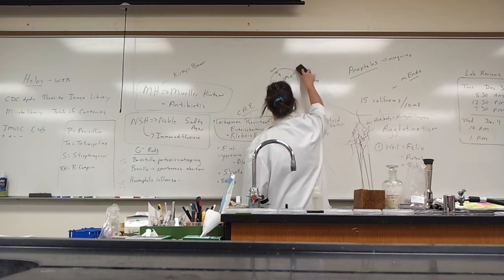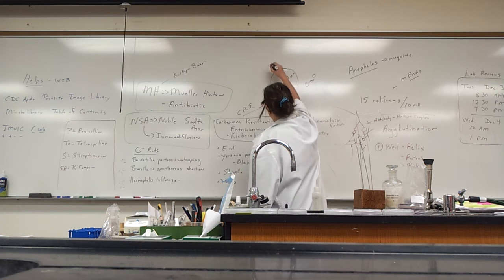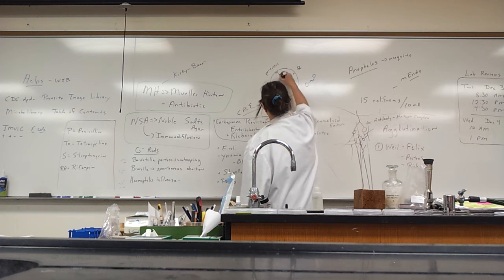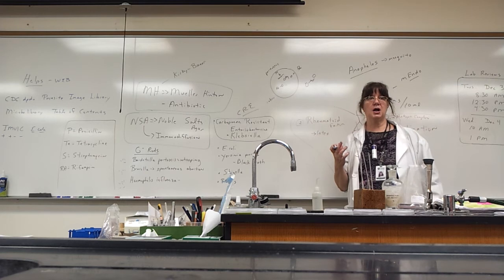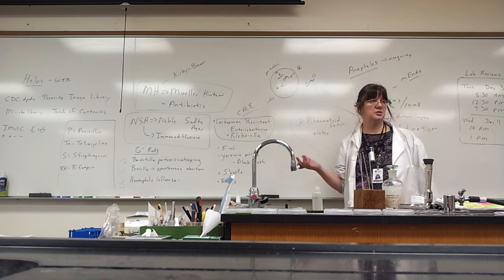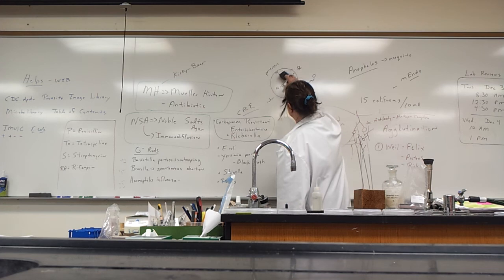What if you had a patient, with pertussis, flu, and maybe rabies. The line forms there, that pale white line, which is the antibody antigen complex, where they match. That person had what? Pertussis. Bordetella pertussis.